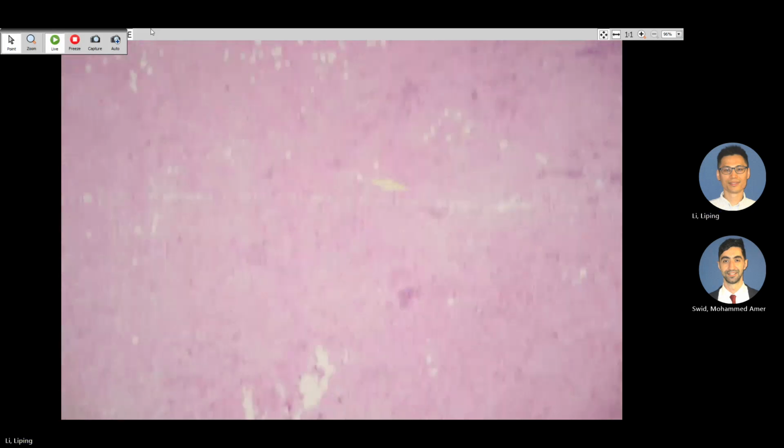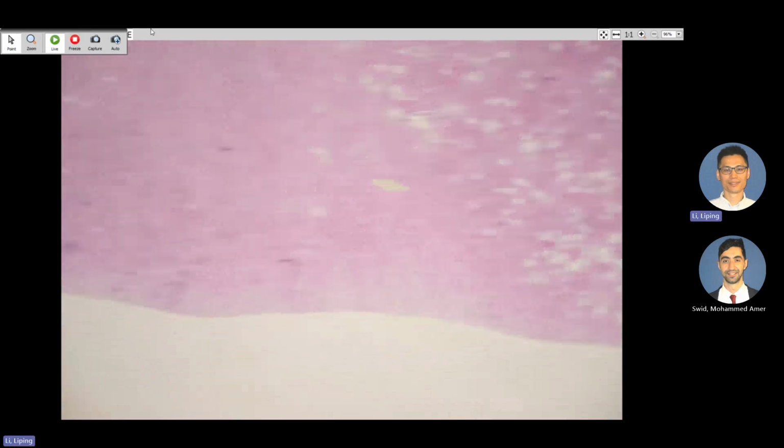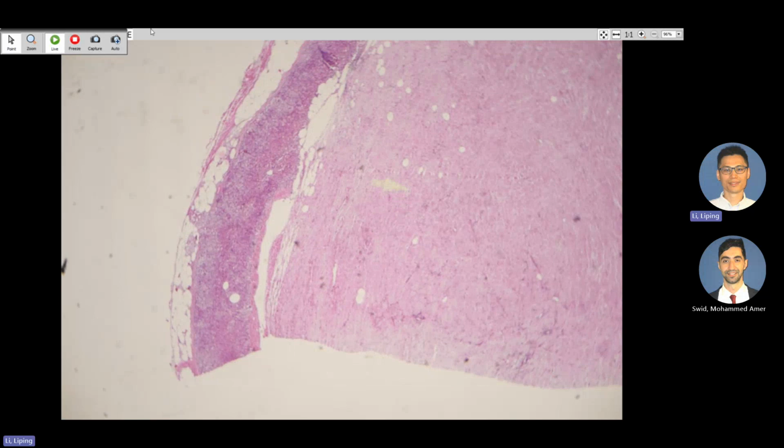This one looks quite different from the previous two, even though they are in the same category. This is a normal adrenal gland, right? And then we have this, also well circumscribed, but this time we can see this spindly proliferating stroma. That is the Schwannian stroma.